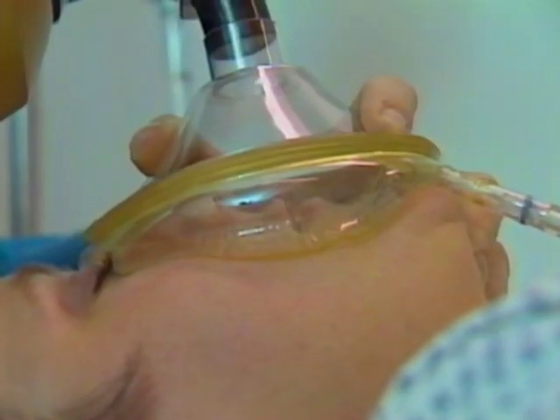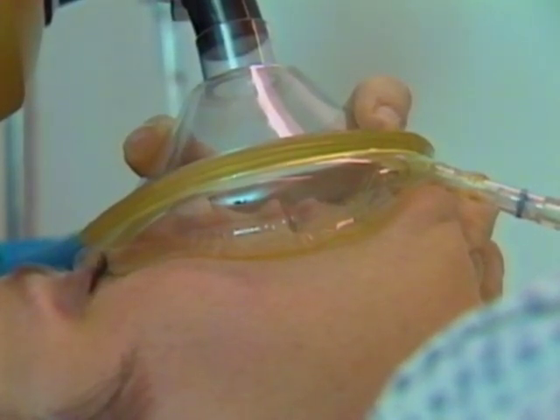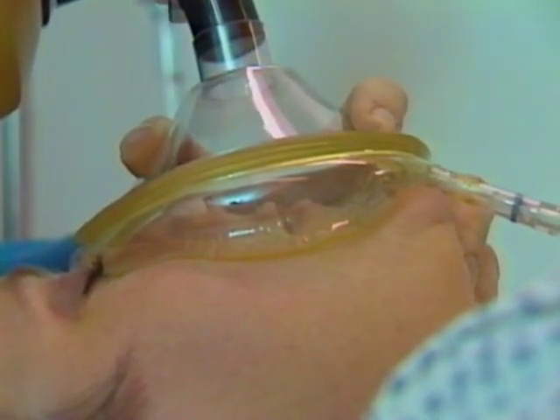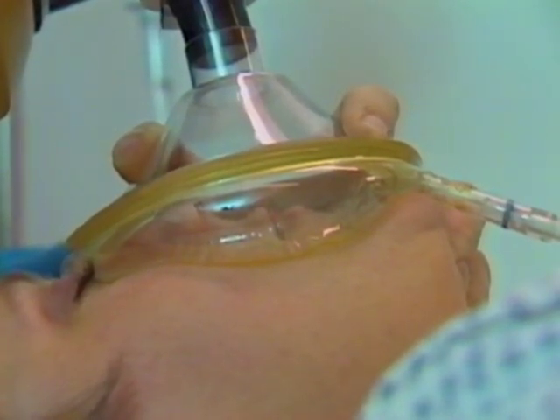If you have a good mask seal, little or no air will escape around the mask. You can tolerate some leak as long as you can ventilate the patient. If you don't have a good seal, then you must get a better fit. Typically, the leak will be on the side with the bag, opposite the hand holding the mask.